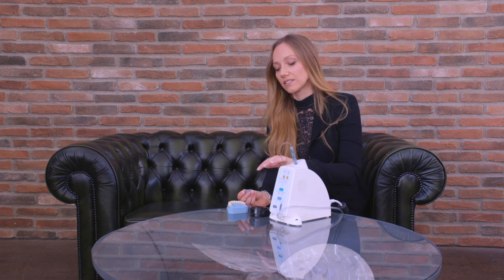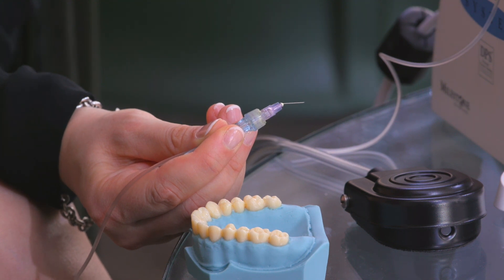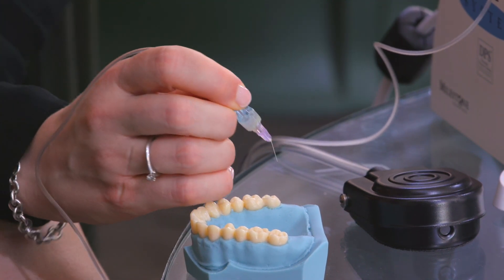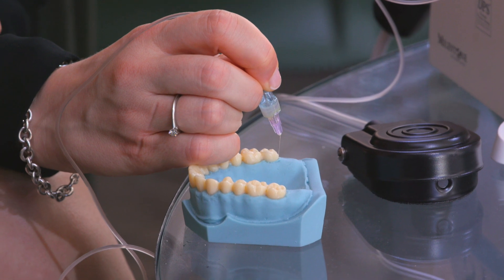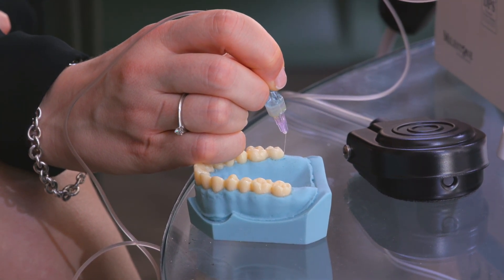To gain an easier access, you can consider bending the needle. Just make sure that the bevel is towards the root of the tooth you want to anesthetize, like this. Then, you can put your needle in the correct position to start the STA anesthesia. To start the anesthesia, you just have to press the button and wait some seconds.